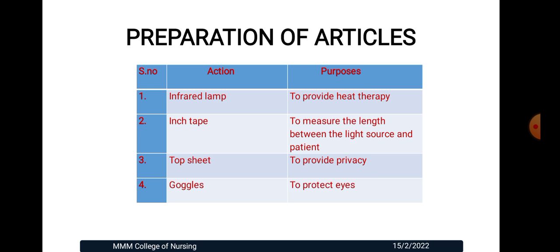Preparation of articles. Actions and purposes. Infrared lamp: purpose is to provide heat therapy. Inch tape to measure the distance between the light source and patient. Top sheet to provide privacy to the patient. Goggles to protect the eyes.